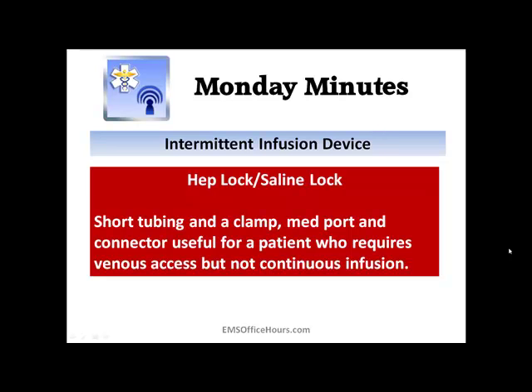And this is that short tubing. If you're not familiar with it, it's usually just that short little tubing, okay? And it has a clamp on it, okay? So you don't get any backflow into the tubing. It's got a medication port on it and a connector that you can connect, let's say, a larger amount of fluid.